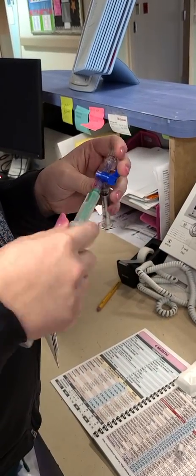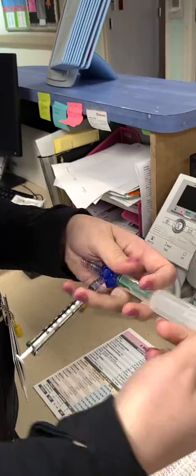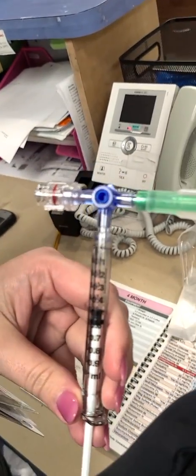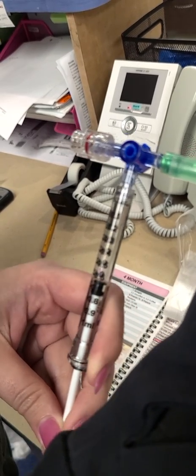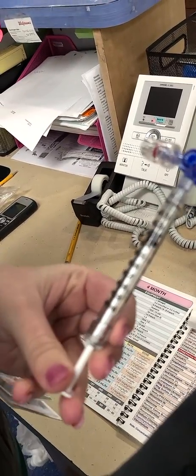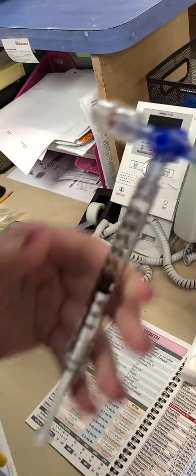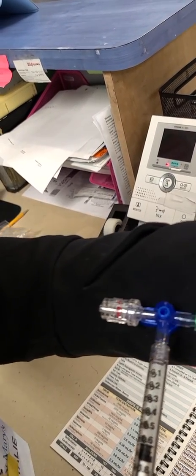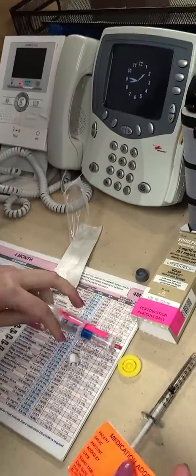We draw back that syringe to 0.6 ml. We'll just turn that stopcock so that it flows in. We would put a red cap on this so that we know that the dose is given, and we can make our med label here with epinephrine.